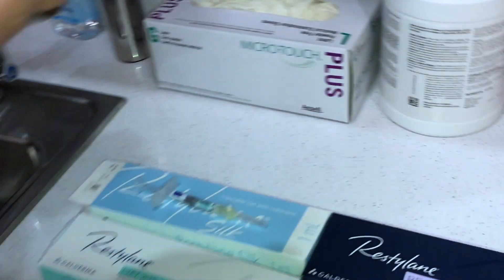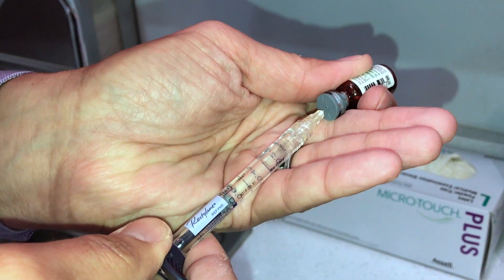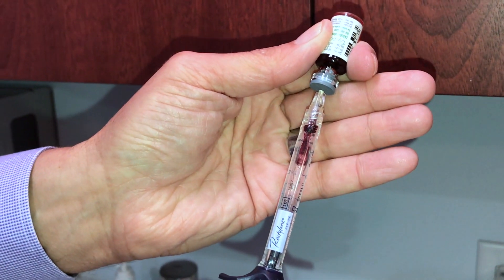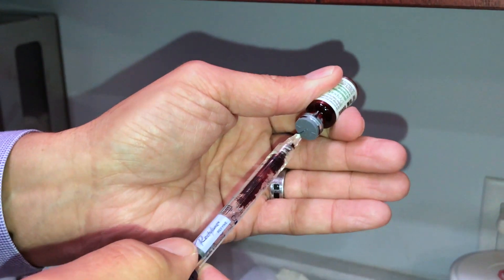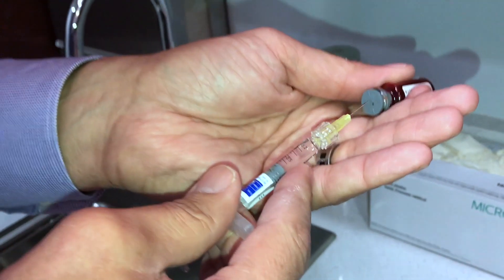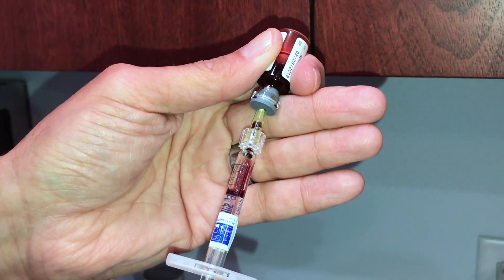Now let's try Restylane Refine. Aspiration — blood. So aspiration works with Restylane Refine too. Let's do the aspiration with Silk. Aspiration works with Silk as well.